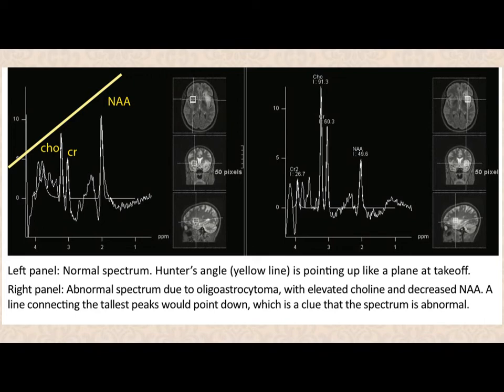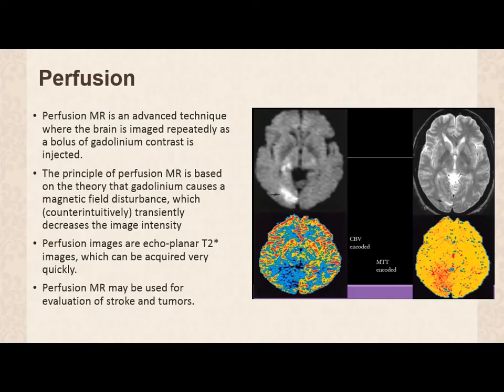However, never ever report spectroscopy without having the full brain MRI. It's not a study by itself. It's complementary to the brain MRI. You don't report spectroscopy without it, and there is a very nice lecture on spectroscopy on our YouTube channel. See it, it's very important.